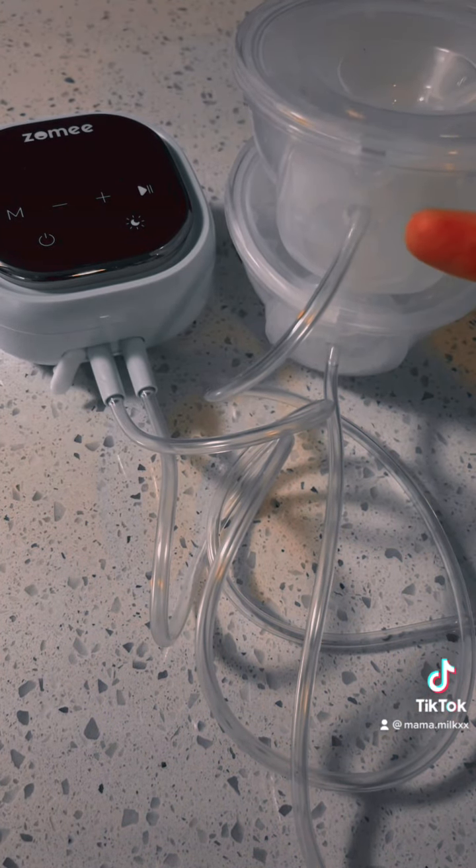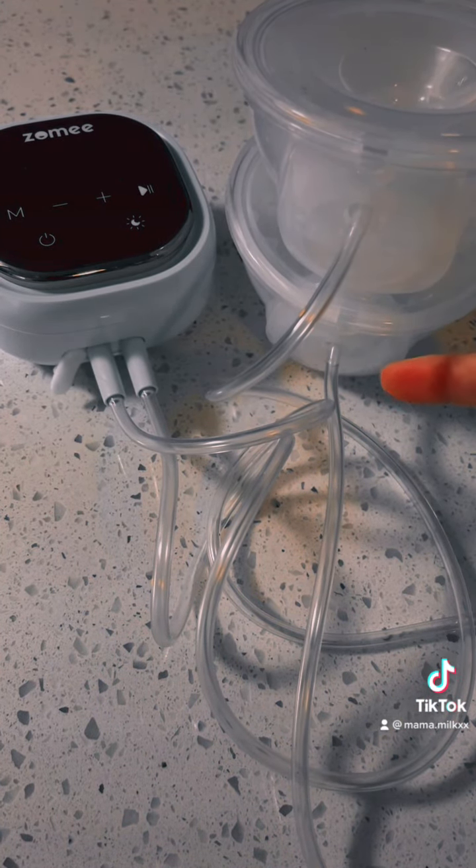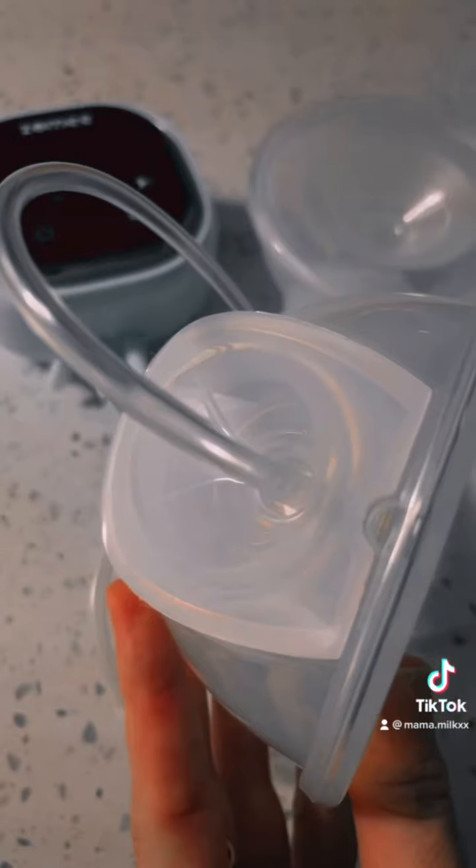And mamas, just a reminder — make sure your tubing is connected to the collection cups appropriately. This will make or break your experience.